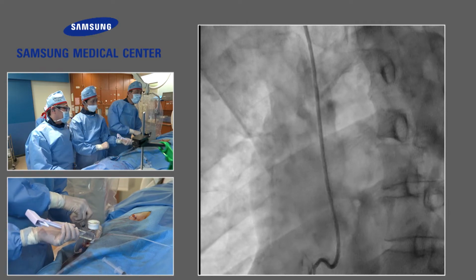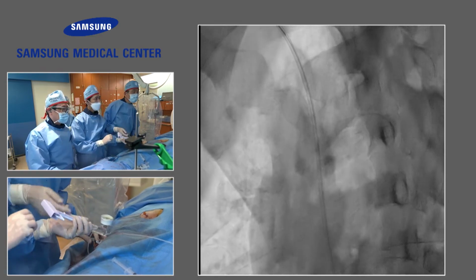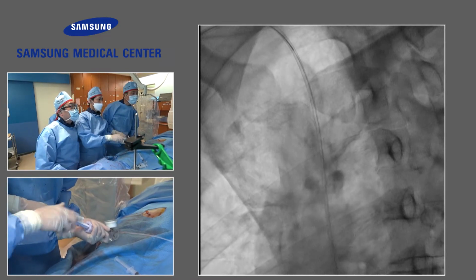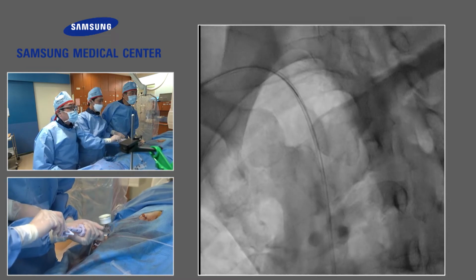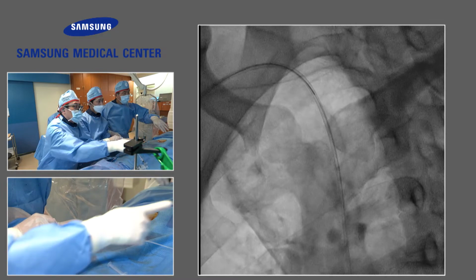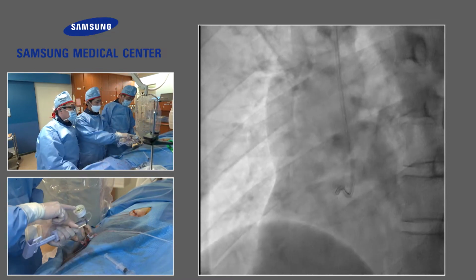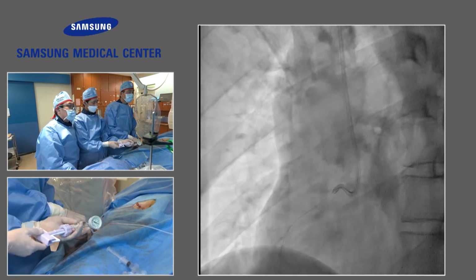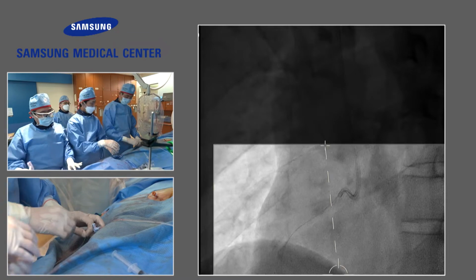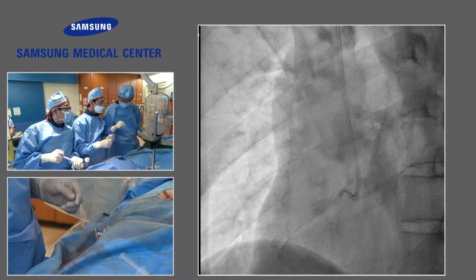Actually, I've heard that several trap balloons are under development in Japan. Is that right, Dr. Ochiai? Looks like it's ruptured already. Pressure is maintained.